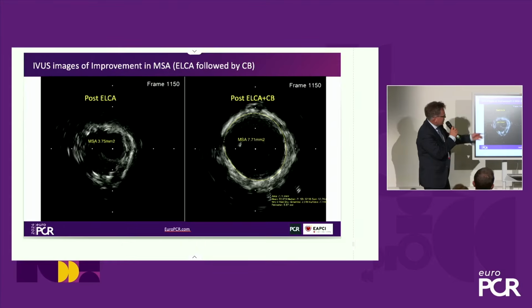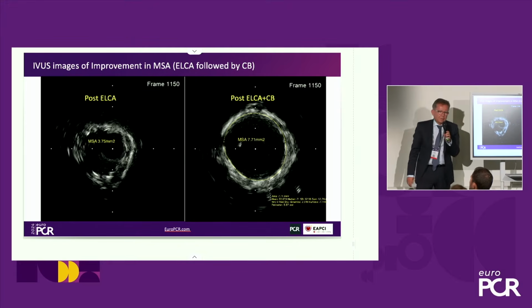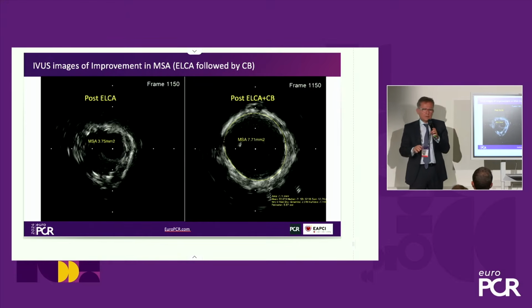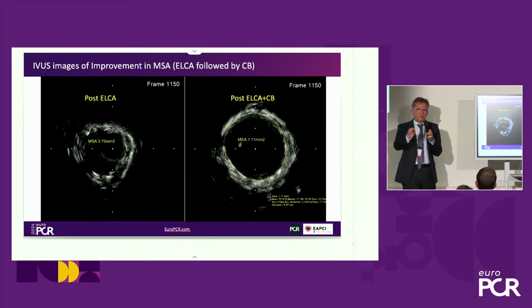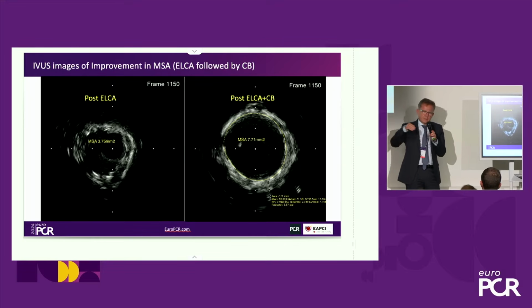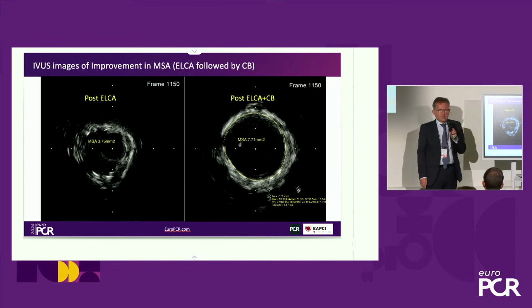Excellent. As you see, it's an excellent case presented by Kriti. It's the situation just after the ELCA passage. It was a 0.9 millimeter catheter. I just memorized that it's the most powerful catheter possible to achieve on the market. It has a very good profile, comparable with a non-compliant balloon. It's very smart, with very good crossability, and we have achieved a lot of energy.